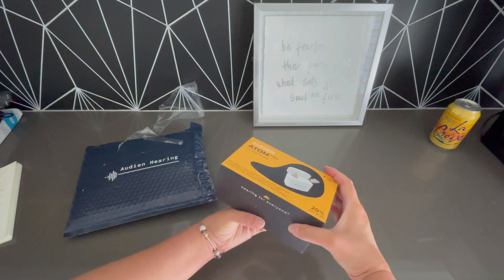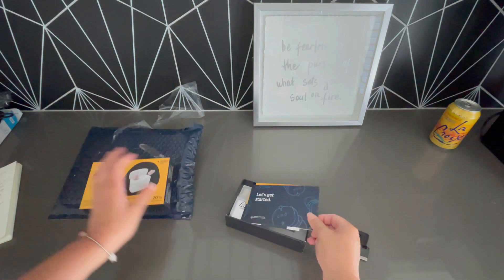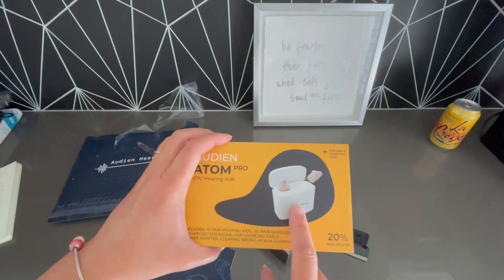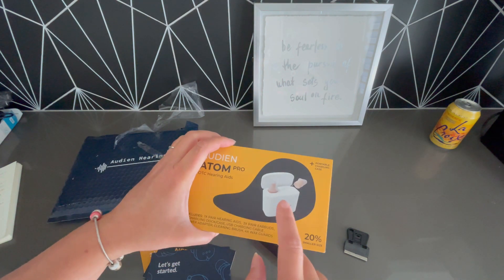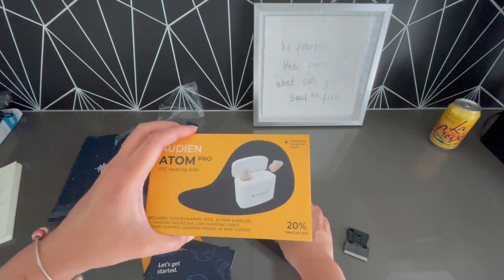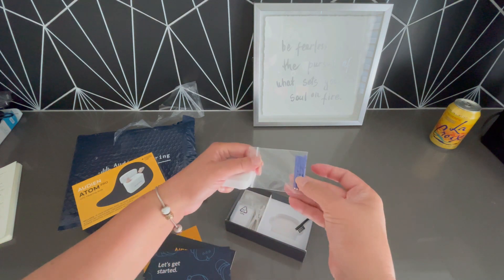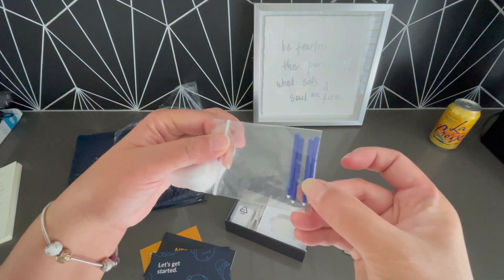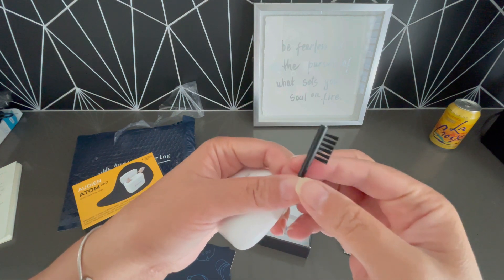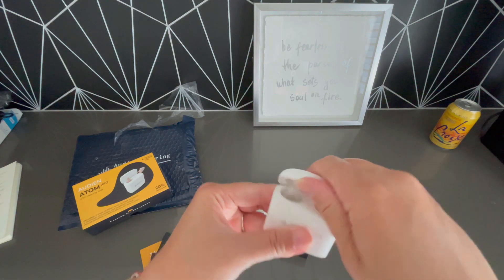They have several different levels of the hearing aid with different features. This one specifically comes with a carrying case, a longer battery, and noise cancelling. Here are some little sticks — this is for cleaning. And here are the actual devices.